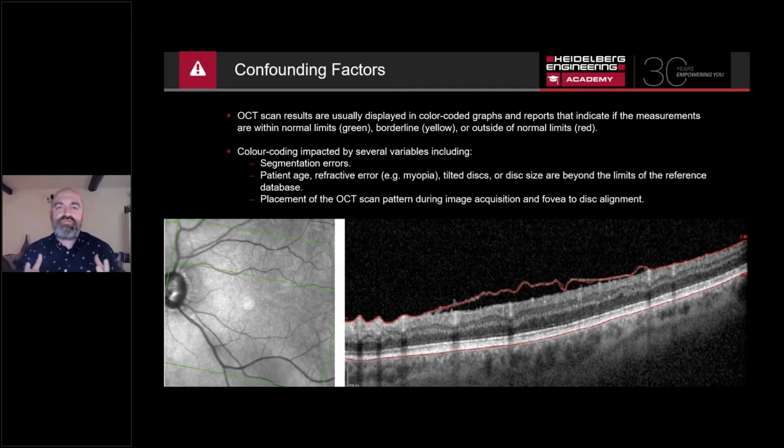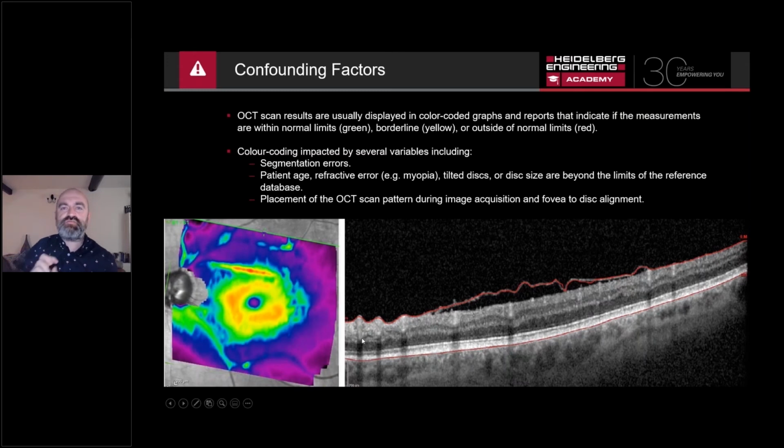Of course, they will affect what the algorithm is doing, which is trying to measure the retinal nerve fibre layer. And as you can see in this example here, we have a B scan of what should be the profile of the inner limiting membrane, but actually what it's doing there is jumping up and drawing around this epiretinal membrane on the surface of this retina. And the effect that gives to the thickness information is it creates this false horizontal line.